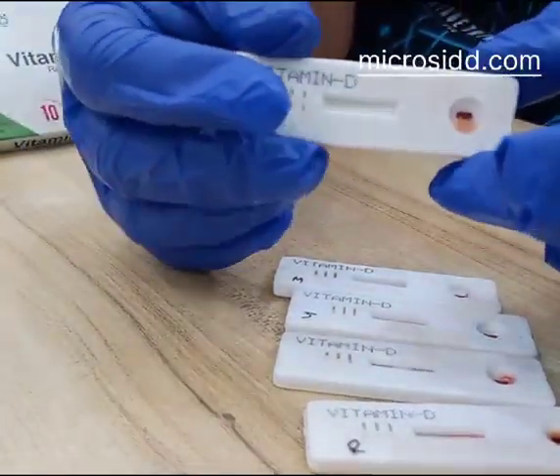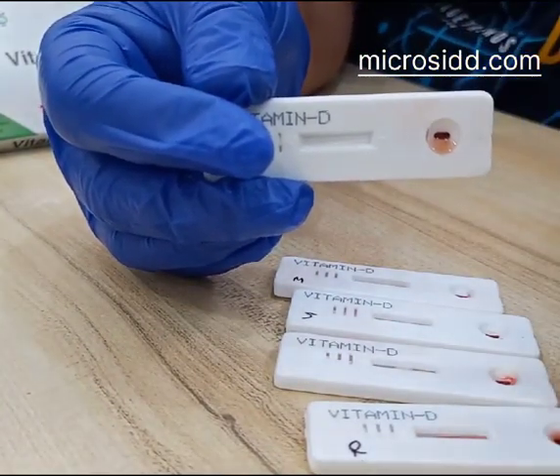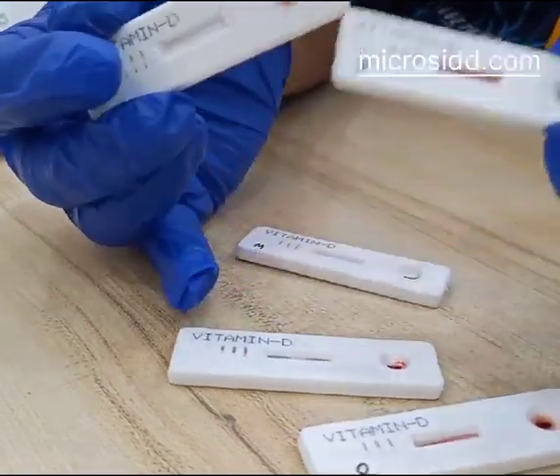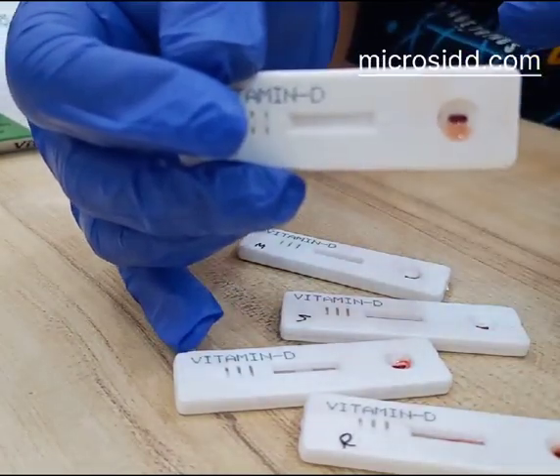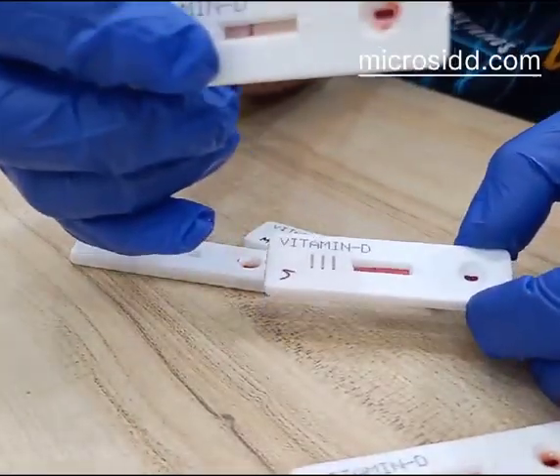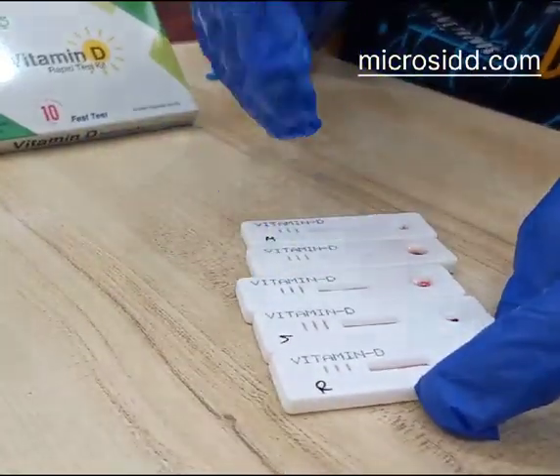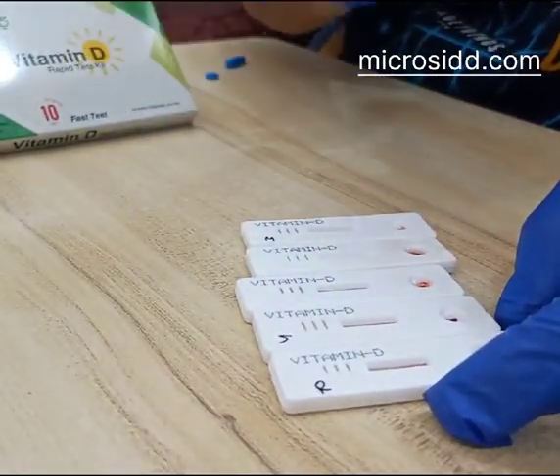In this case the sample is low and buffer is low, so the test has not completed — put one more drop; there is no problem if you put more sample, it will come out like this. If you put less, the result becomes invalid. So put the correct sample and you will get a valid result. One control band — one line — shows a sufficient quantity of Vitamin D. The other cases are negative.